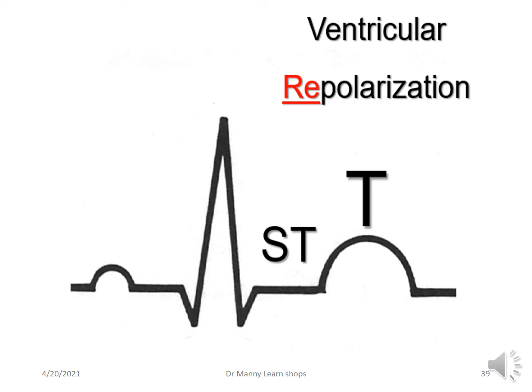Now, what I haven't shown you here is atrial repolarization. And you can look it up, or if you want, you can let me know, and I can give a topic on that. But it's in the literature, and you can look at it on Google. And atrial repolarization is represented by what is called the TA wave, the atrial T. And you don't see it, but it follows the P wave, which is the positive deflection, as a negative. But it's typically hidden in that flat line that you see, which is called the PR segment, the TA wave.